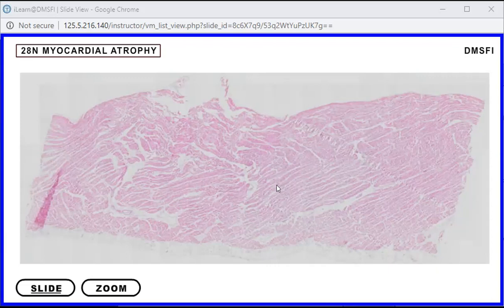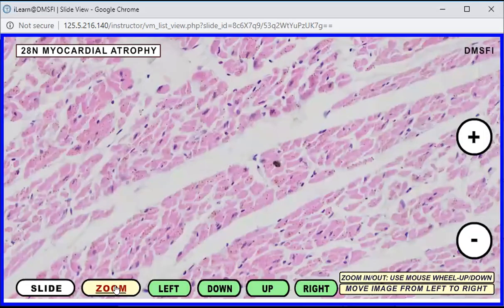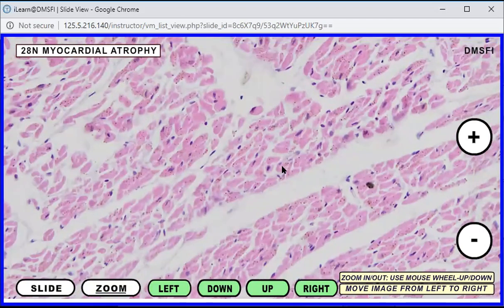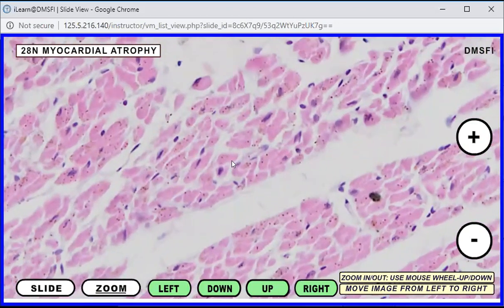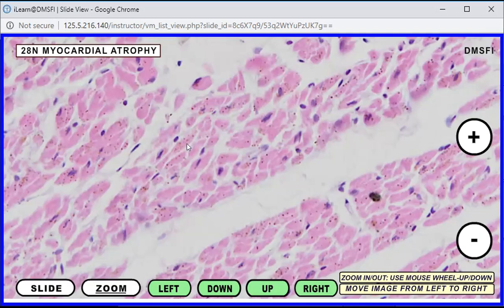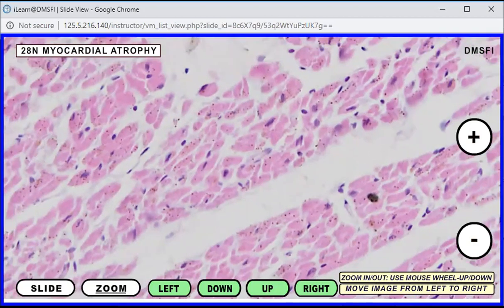Looking at the slide for atrophy, you notice the myocytes have thinner thickness — their widths are smaller than usual. Comparing that with hypertrophy, these cells are thinner. Also notice the size of the nuclei: they are smaller. This is a perfect example of atrophy on histologic slide.